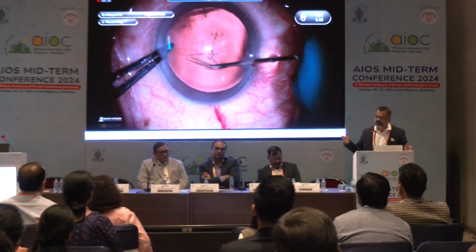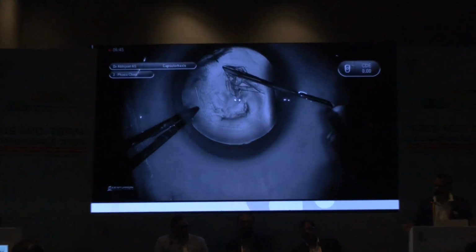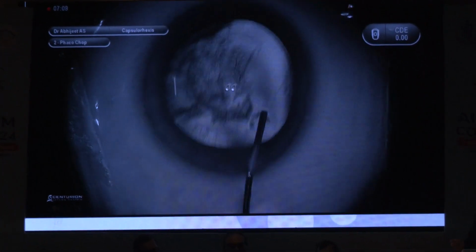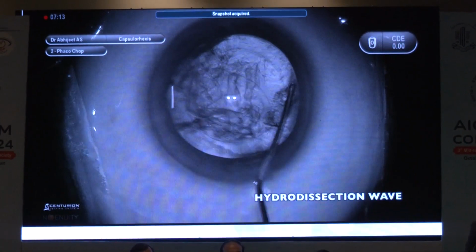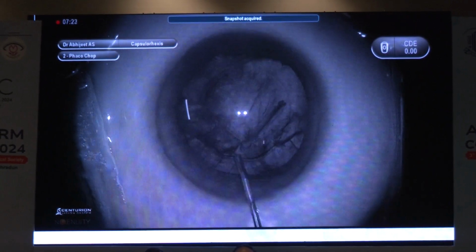So this is basically on Ingenuity, which is a 3D heads-up surgery, and we incidentally found out this filter called the monochrome filter. We were just trying some different things, and we realized that because of the change of the entire high dynamic resolution into a single tonal value, you get an enhanced glow and an enhanced contrast in certain steps of cataract surgery. Like this is especially done in rhexis. You can see the hydrodissection wave much more enhanced than what you would see in color.